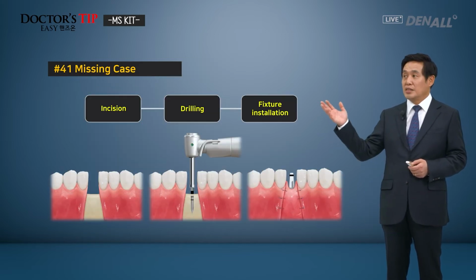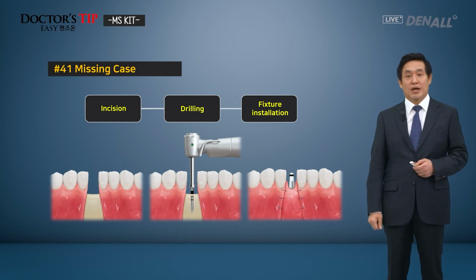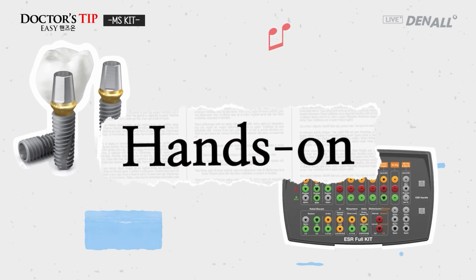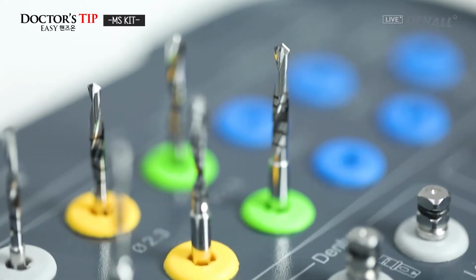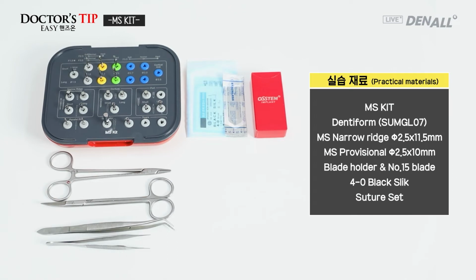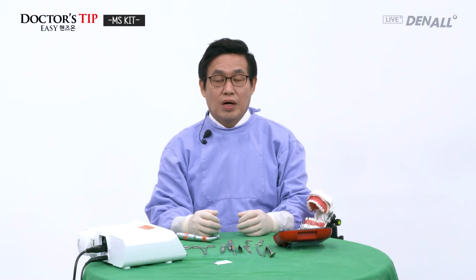So this is the case. 41 is missing. For that case, first I do incision and drilling, and then the MS fixture will be installed. I will see you in hands-on practice. So now I'll do hands-on for the MS kit.